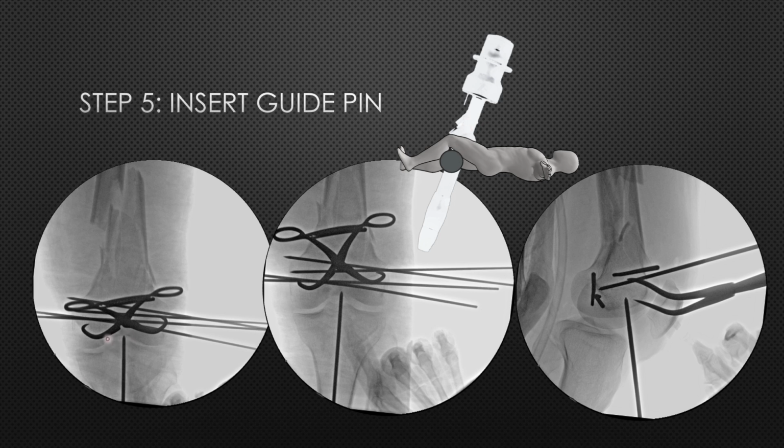So it is not clearly visible here. The joint space of the condyles is kind of obscured, but when we tilt the C-arm, we get a better profile of this view. So sometimes when your implant or K-wires are hindering this terminal part in AP view, here it is not happening. But if it is happening, what you can simply do, you can simply tilt the C-arm towards the direction of hip flexion. That will show you the true AP view, and you'll be able to better appreciate the top part of this entry area that we have discussed.